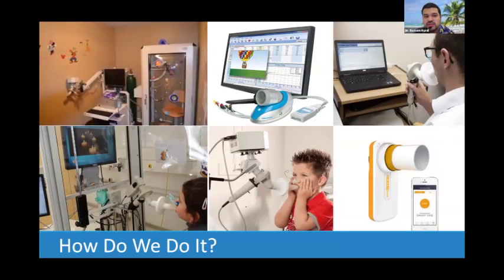As for how we do it, Dr. Noor gave all the information you need. I'm not going to elaborate on the process, but I just wanted to show some pictures. So this is the box. I don't know if you can see the marking. This is the box of the plethysmograph where we put the kids who can perform lung volumes.